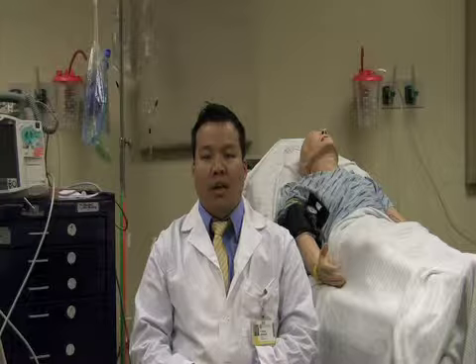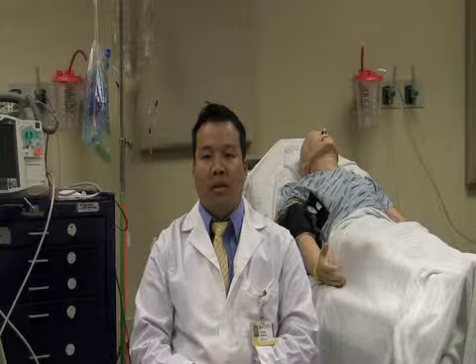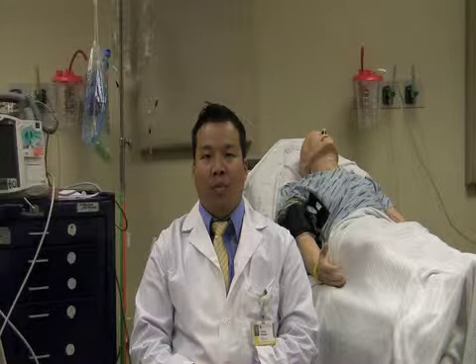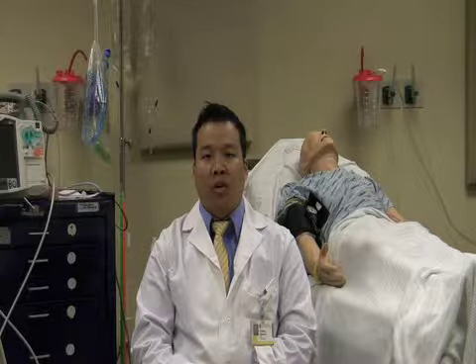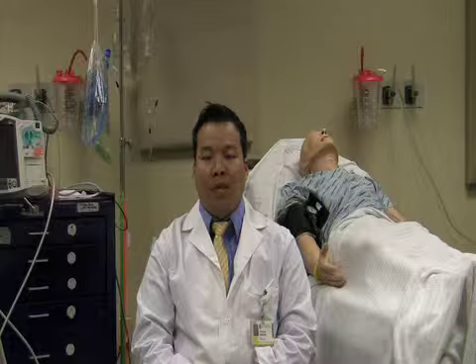This is typically because there is low battery that may cause an inability for the pacemaker to properly sense. Pacemaker failure may occur because of a dysfunction within either the lead or the pulse generator.